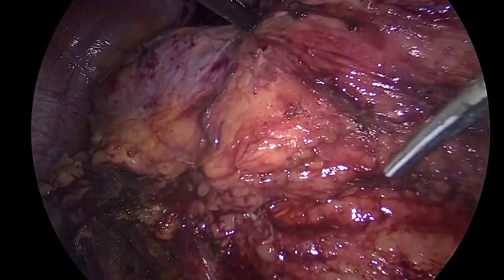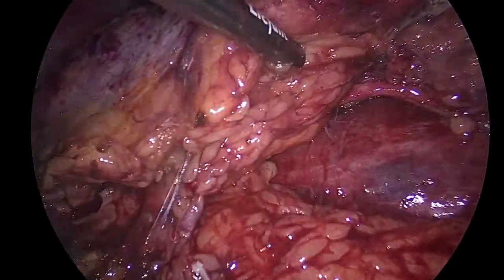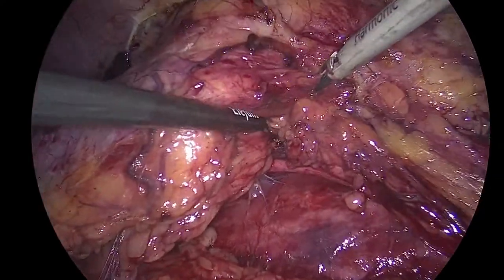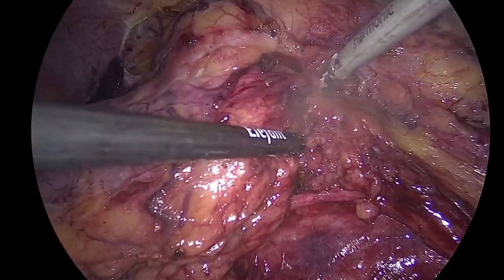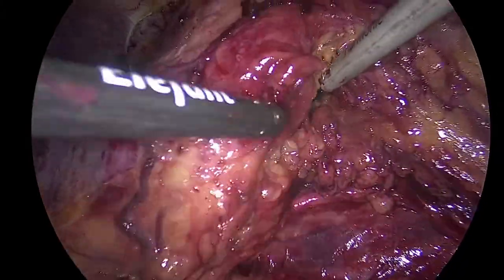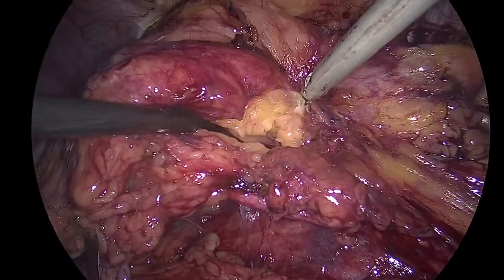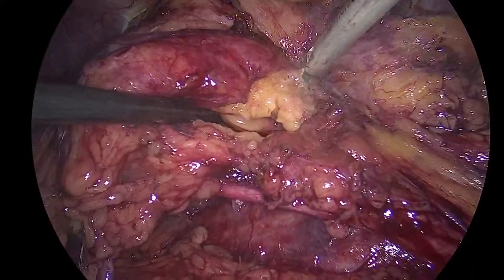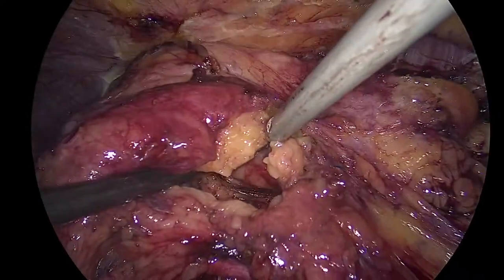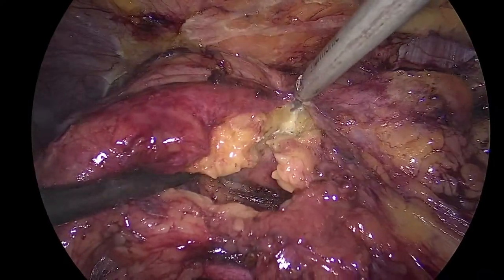First of all, one of the problems that you have in these cases is that you go and you actually inadvertently traumatize the ureter. So that's why I'm going to divide the tissue here, because it happened to me once that when I was doing a lower pole partial, I actually cut the ureter, which you have to re-anastomose. What did you do? You have to re-anastomose it afterwards. End-to-end anastomosis, but it's not fun.